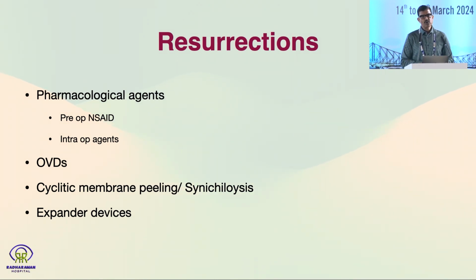High molecular weight OVDs cause a mechanical dilatation, but that stays for a very short while. And if you can finish off your work before the pupil constricts again, fantastic. Otherwise, you have to continuously refill the AC. Cyclitic membrane, if it is there, it has to be peeled off. We'll see how to do that. And of course, the expander devices.